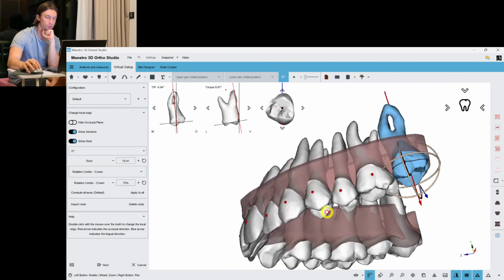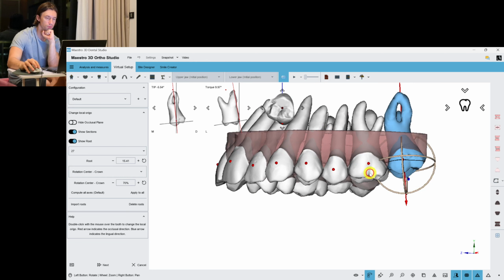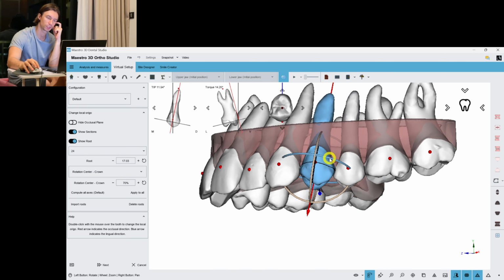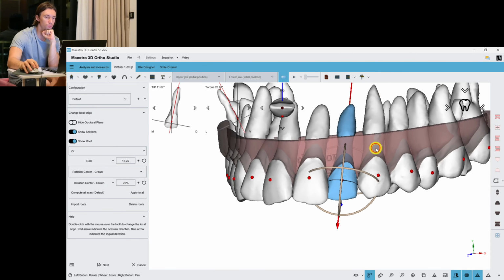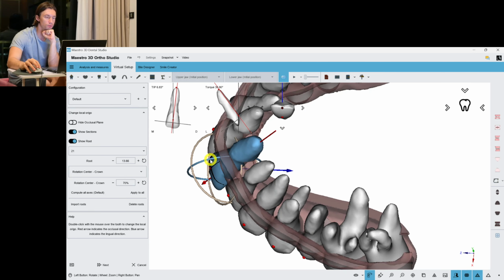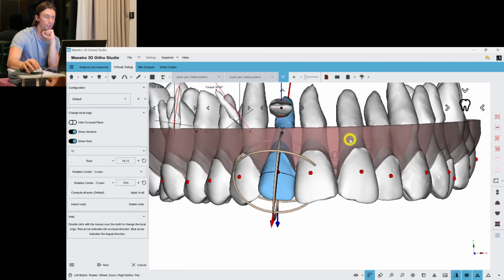I think here we also can make some distalization to reduce the IPR in this area. Also long roots. Okay. We use a good plastic material. I'm going to use a Zendura Flex here. And by the way, in a few weeks I'll get my graphy stuff. And I'll use graphy material for my complicated cases. Not for cases, for movements.